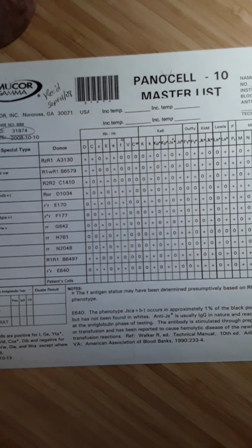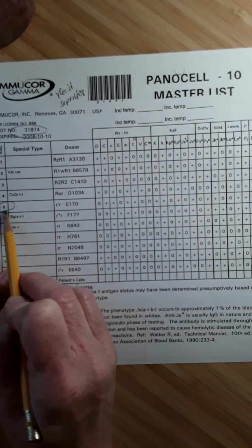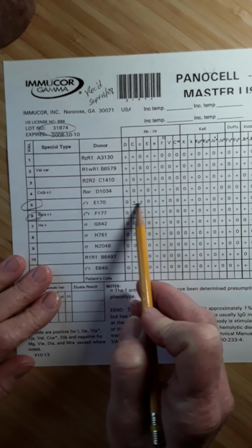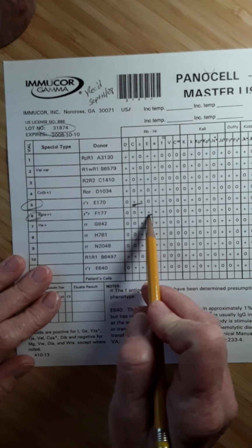And the same thing for big E. I want to find a D negative cell that's positive for big E. And if it does not react, when I react that cell with my patient's plasma, with PEG added and taken through IAT, then I'm going to put my second slash on big E. So the two cells on this panel that I really quite like are cells 5 and 6. Cell 5 is positive for C, and cell 6 is positive for E.